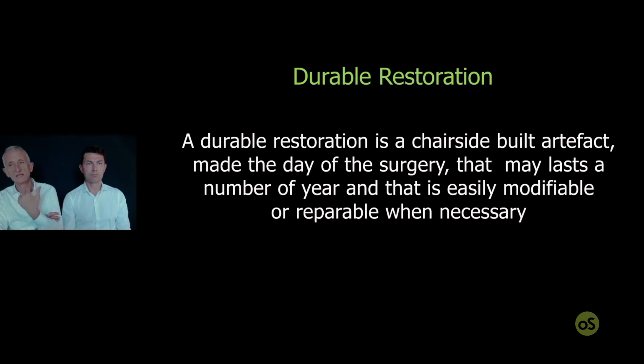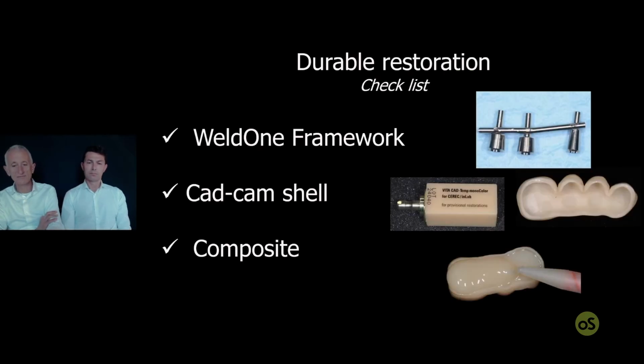Today we just see the lab technician aspect of the concept. So durability is the result of the addition of three fundamental aspects. One is the shell, the second is the framework, and the third is the relining material.